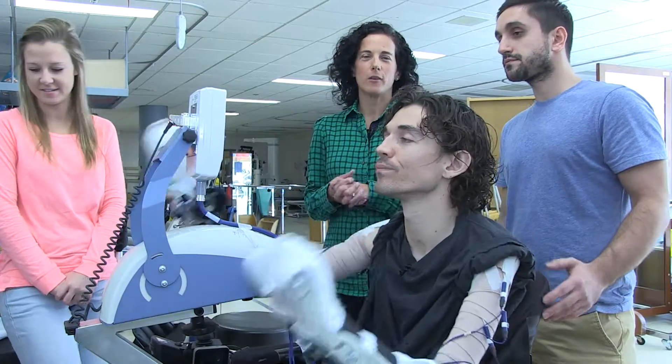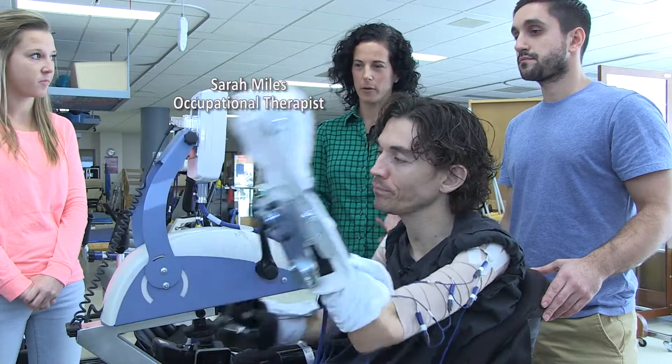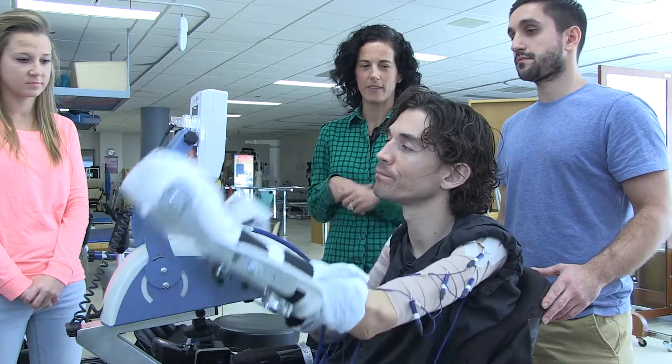At Parkwood Institute we have an outpatient spinal cord injury program where we've just piloted this component of our program, which is the Upper Extremity Functional Electrical Stimulation Program, called Upper Extremity FES for short.